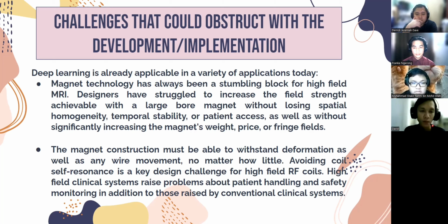The magnet construction must be able to withstand deformation as well as any wire movement, no matter how little. Avoiding coil self-resonance is a key design challenge for high-field RF coils. High-field clinical systems raise problems about patient handling and safety monitoring in addition to those raised by conventional clinical systems.